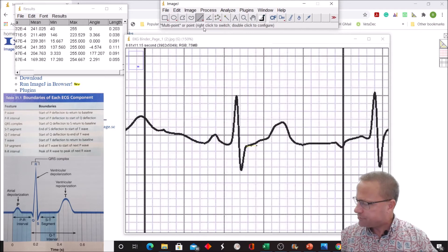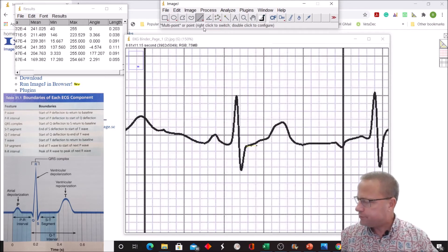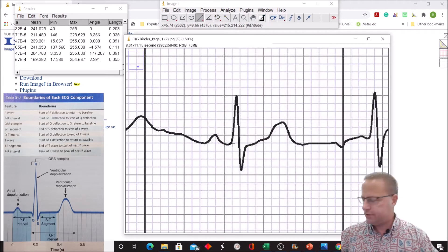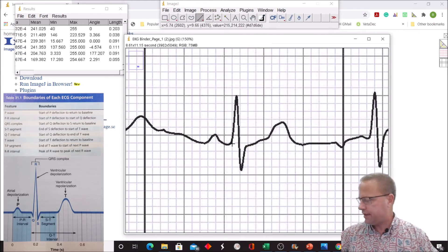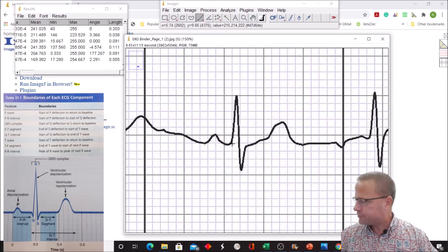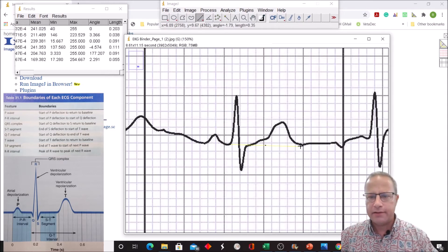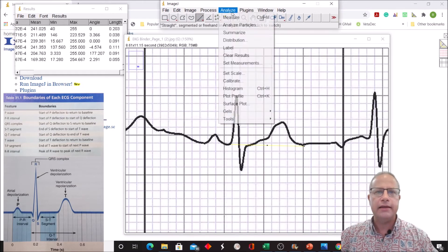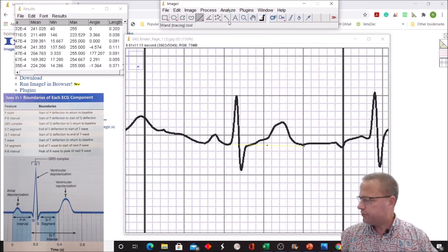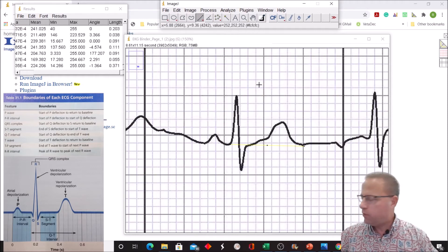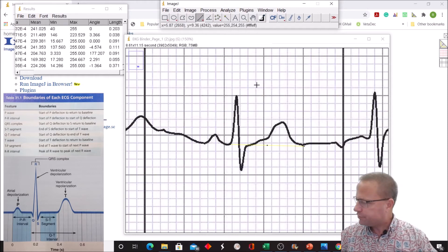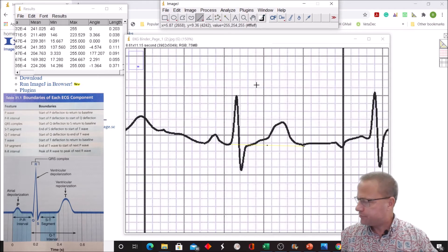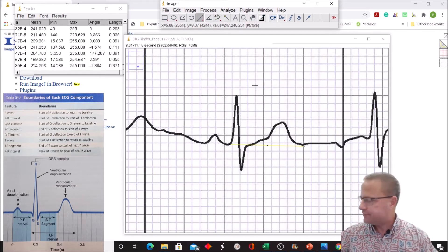Now we're going to measure something called the Q-T interval. Start of Q to the end of T, so it contains both the Q and the T-waves. Start of Q-deflection to end of T-wave, somewhere right about there. 0.371 was our Q-T interval, and that's well within the range of 0.32 to 0.38. That's fine.